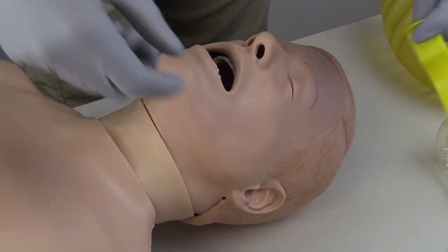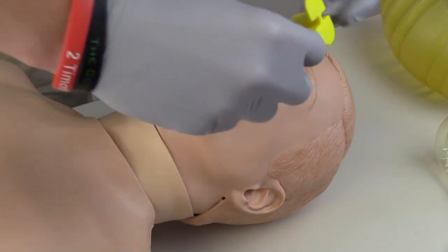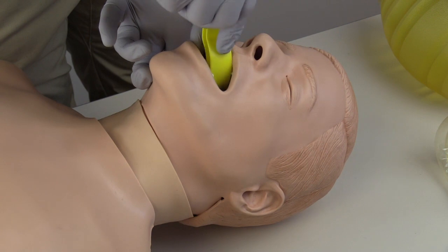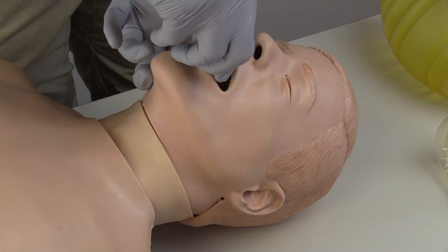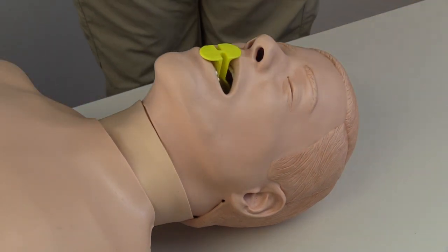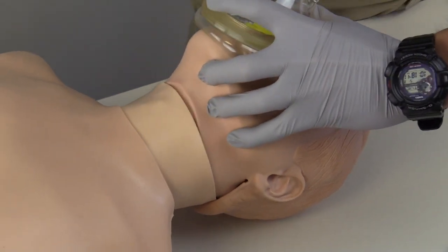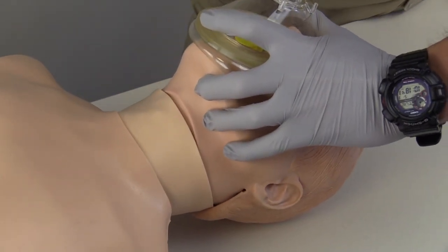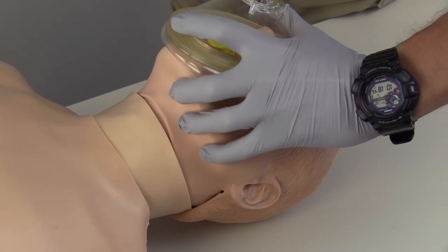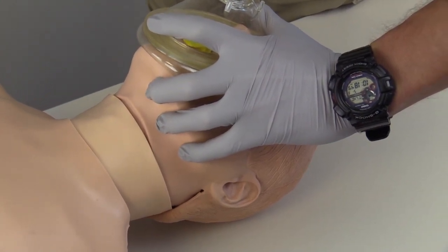Next, I will measure the oral pharyngeal airway from the corner of the mouth to the corner of the jaw. Once properly sized, I will place the oral pharyngeal airway into the patient's mouth in a manner that does not push the tongue into the airway. I note the absence of a gag reflex and that the oral pharyngeal airway is properly placed.